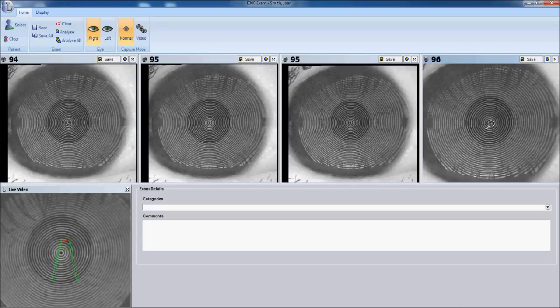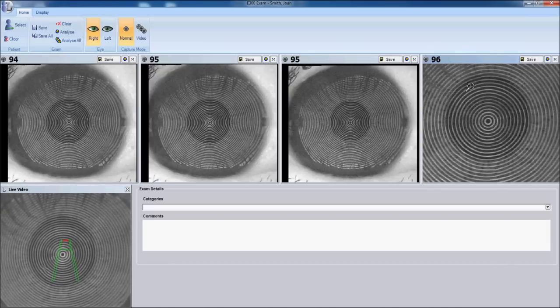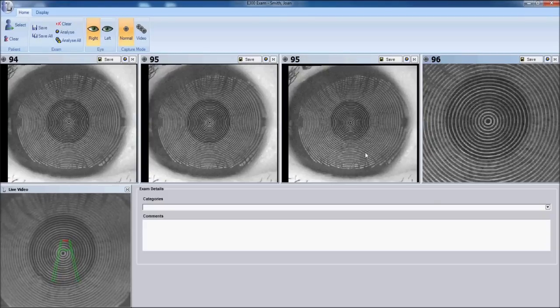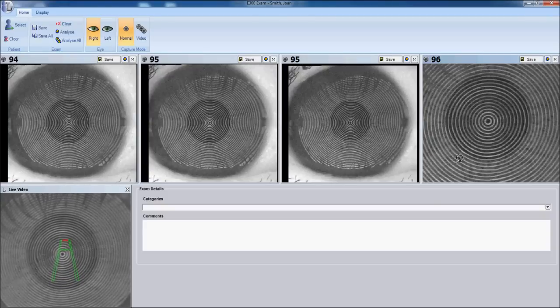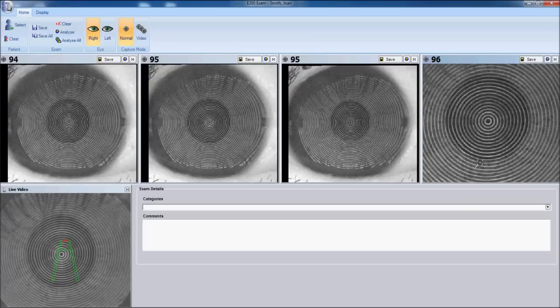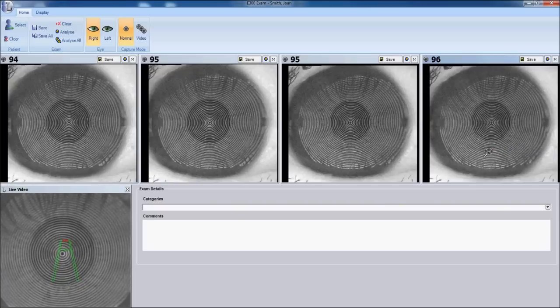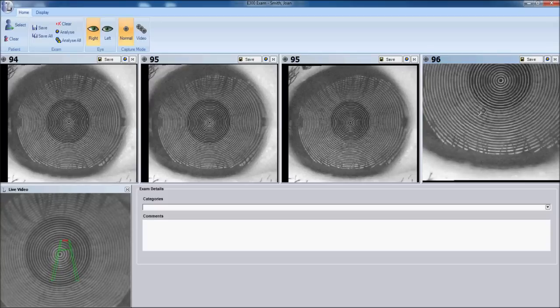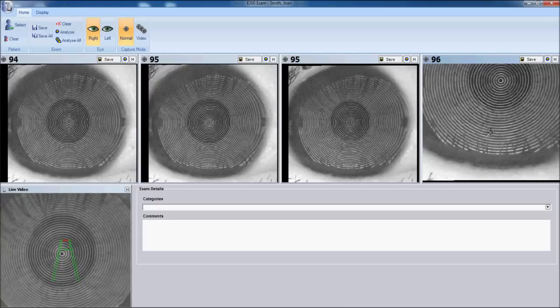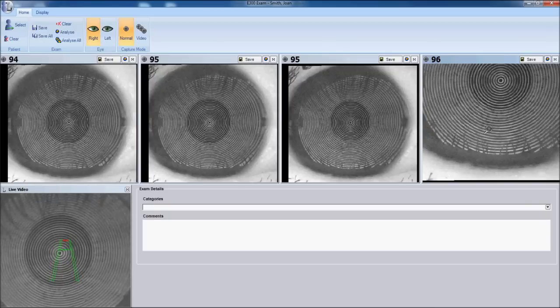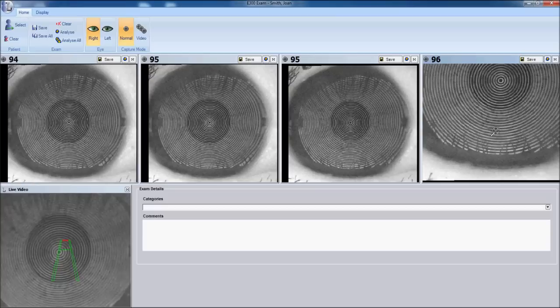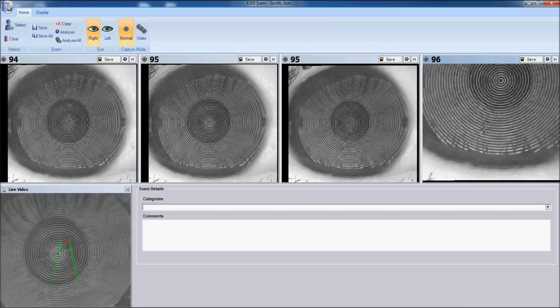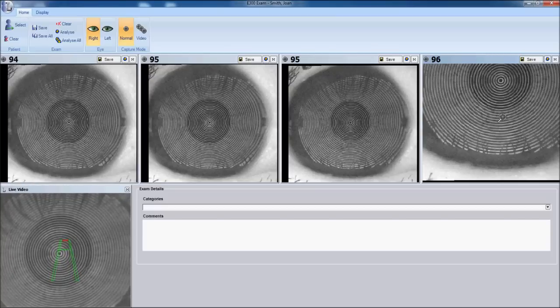Let's zoom in on these central rings. We can see we've got nice parallel ring reflection. It doesn't appear that we have any tear film breakups. Although this area may show a little bit of a distortion and therefore possibly the start of tear film breakups. If we reset this image and zoom in on those inferior rings. Notice this area is starting to show a little bit of distortion. This area is showing a little bit of clarity lost along this ring. So this is the kind of tear film breakups we are going to try to avoid.